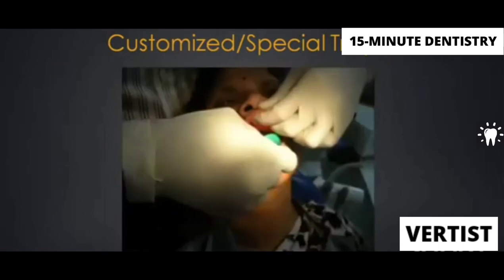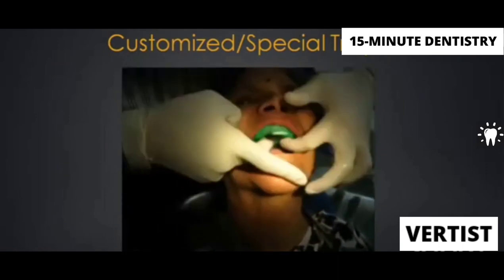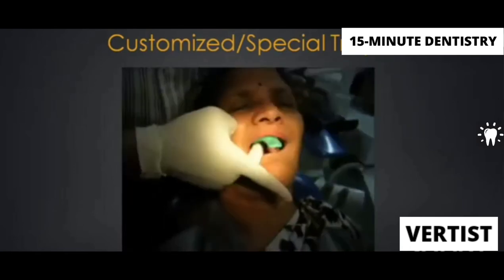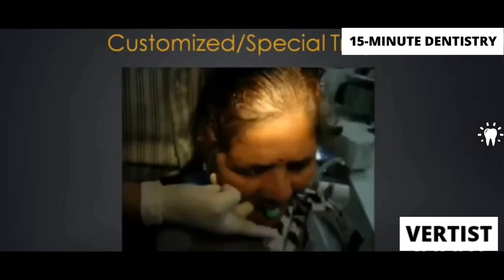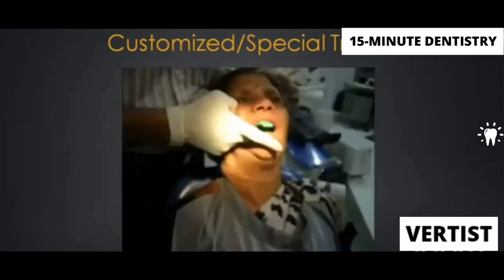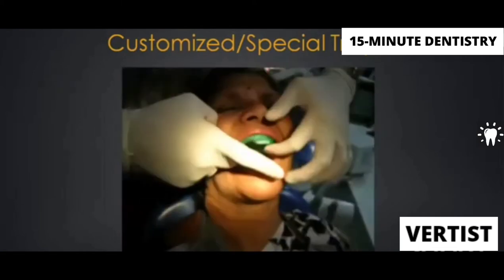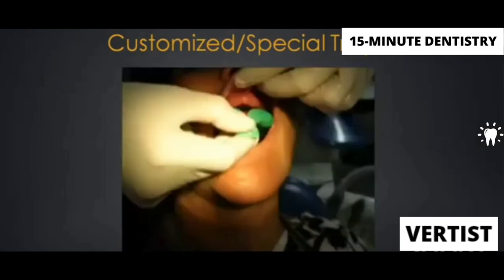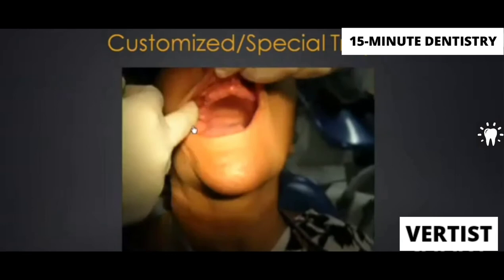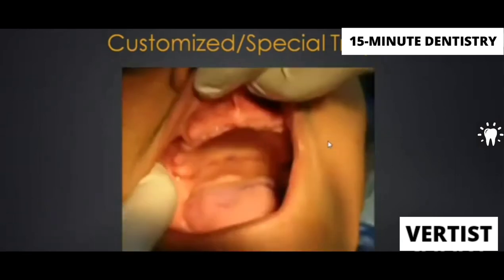When we do this, we are going to get a very nice clear marking on the palate of the patient. Then ask the patient to say ah, and you will see whether our posterior vibrating line extension is correct or not. Okay. You can just ask the patient to look down at around 30 degrees so that the palate falls down. The moment the palate falls down, it will come in contact with the tray and you will get a beautiful marking. Okay, you can see over here. And ask the patient to say ah and check whether this is correct or not. Right?